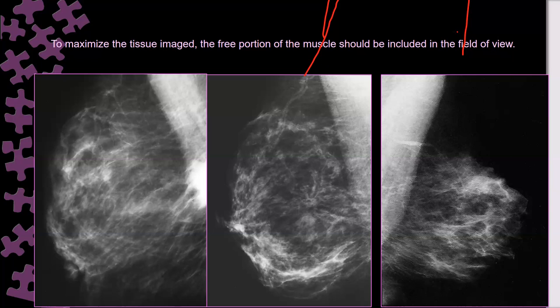I don't know the reason, but what we can say is that this is not a typical mirror image, not a V shape. I don't know exactly what the reason is; the literature did not explain, but definitely there is a lack of V shape. The right apex, the pectoral major slightly compared to the left, is slightly deficient.